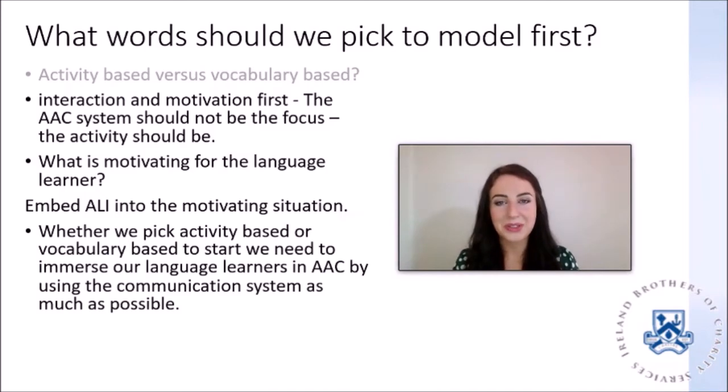Remember, whether you choose to start by modeling in specific activities or using specific vocabulary, we need to immerse our language learners in AAC by using the communication system as much as possible. This is more difficult at the start, but it gets easier as you become more familiar with the communication system. It's also important to note that even if you decide to go activity-based and start with mealtimes, for example, the device should still be accessible and near to the language learner at all times.